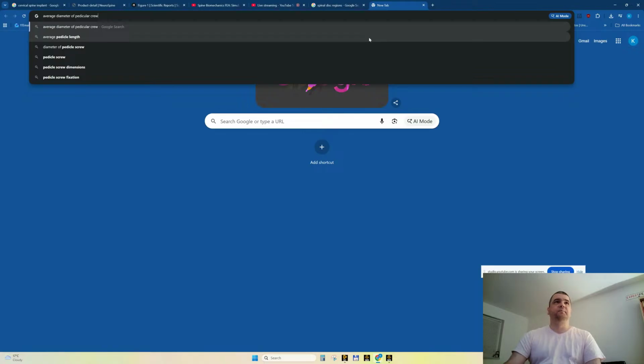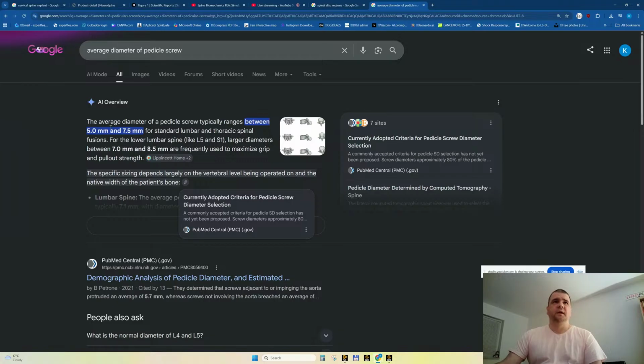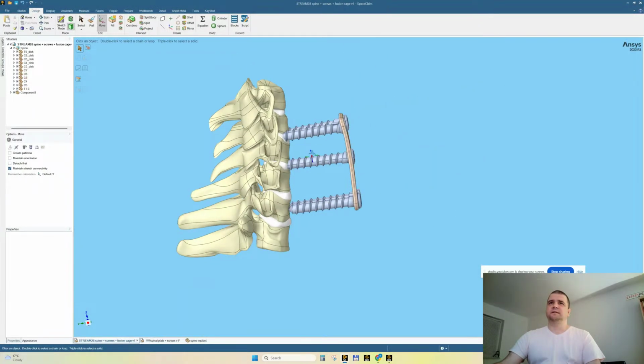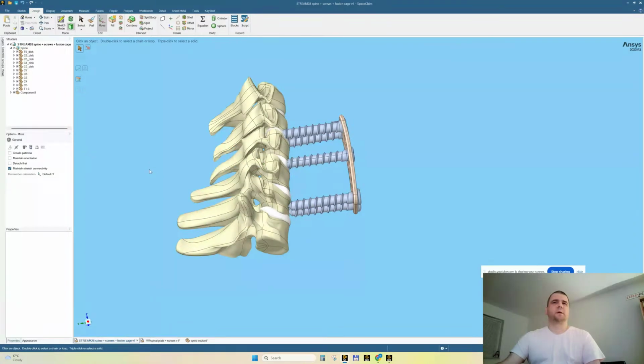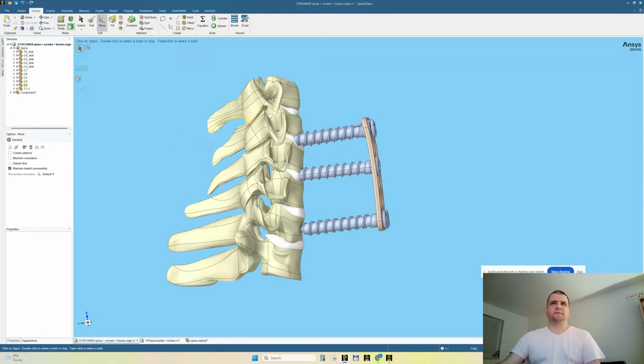Average diameter of pedicle screw. Pedicle, sorry. So it's 5 to 7, and we have double. So let's scale this subassembly by 0.5, because it's too much. So what we can do is, firstly, let's save, and I'm going to hide the spine. Do I hide the spine or not? I'd like to keep it in order to have it as a reference.